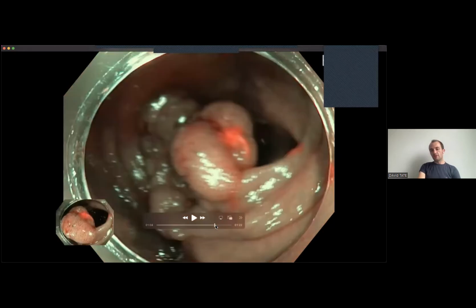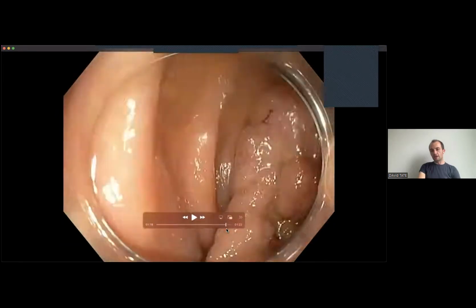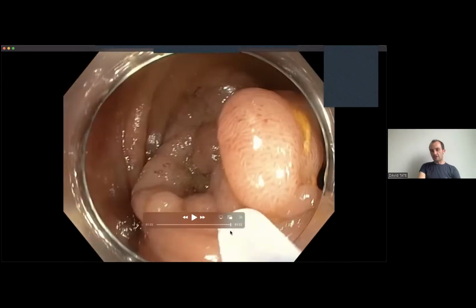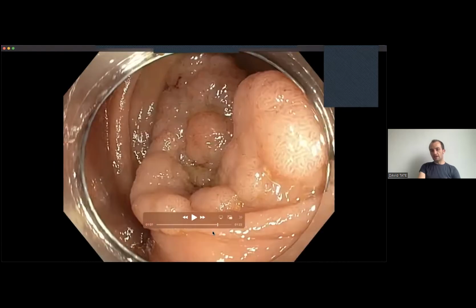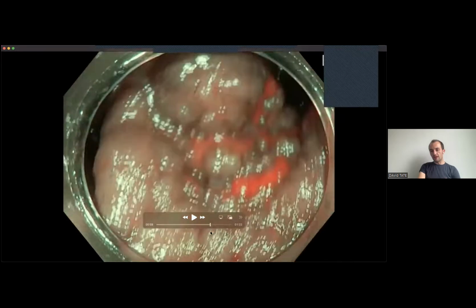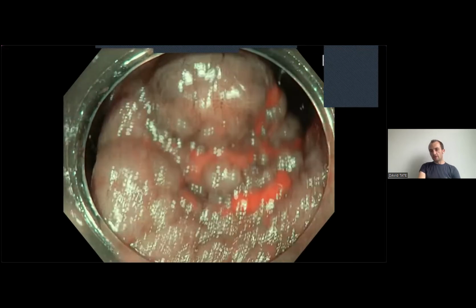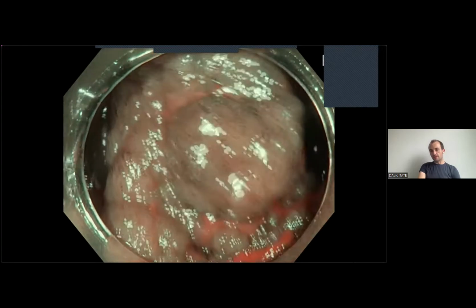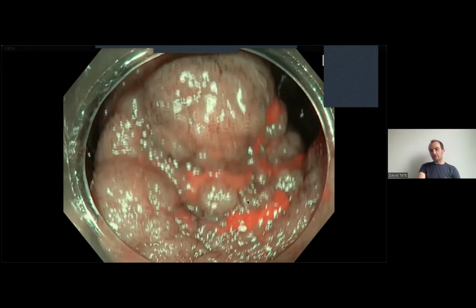And you said to me that there was a depression in there, and then you very nicely said that you thought it might be related to the granularity. I think it's in fact just related to that fold sitting down there in the middle. But the key thing is, if you're worried or thinking about that at all, you should image that area. Unfortunately, we don't have great imaging of that area, but almost certainly you can tell, even from this suboptimal endoscopy imaging, apologies for that, that this area does not contain a totally disordered pit pattern.